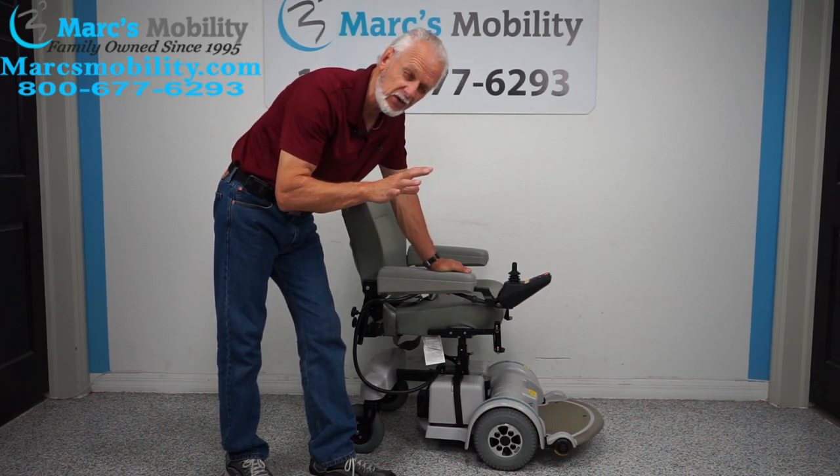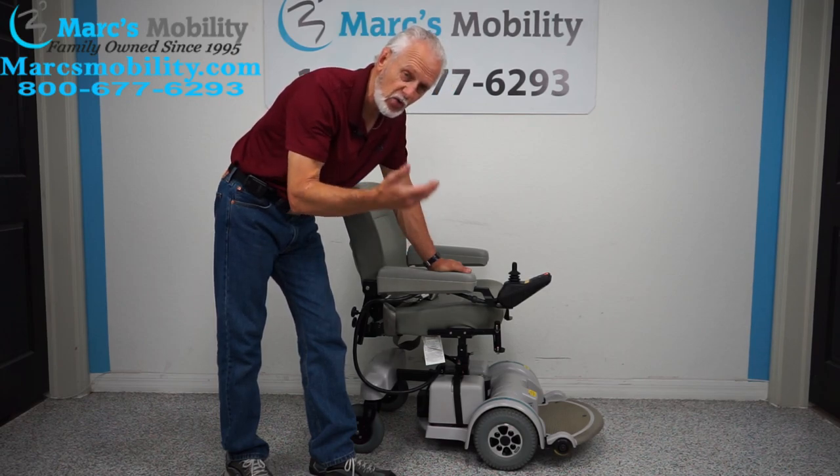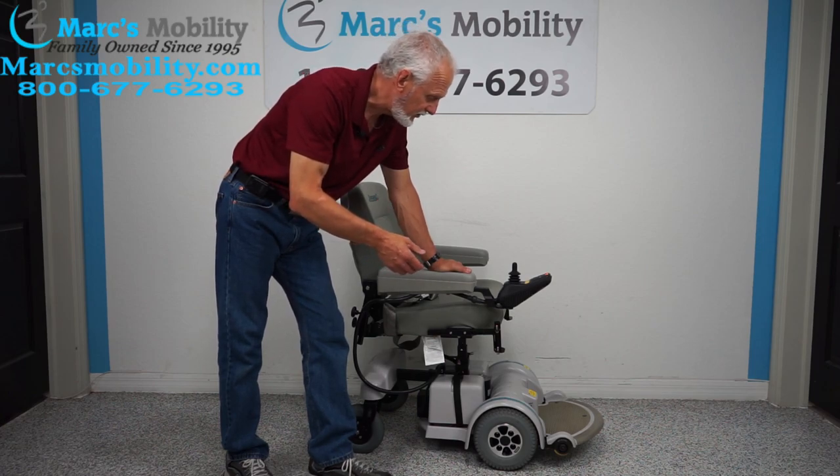This power chair has 50 miles on it, so it was used about three or four months. If a person uses their chair every day, they're going to put about 25 miles a month, so with 50 miles I'd say it was used in a span of two or three months.